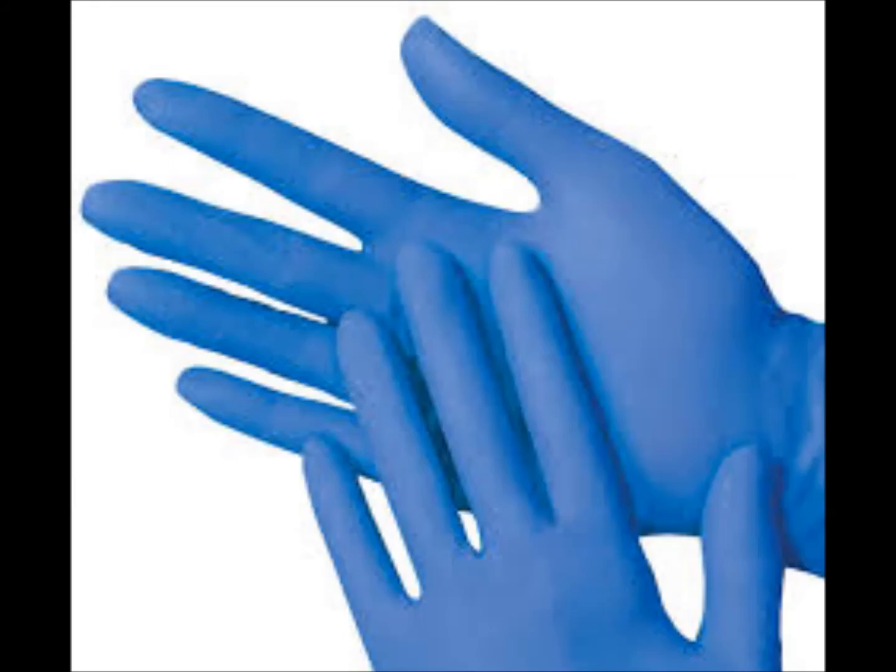Now that we have covered why a patient undergoes a tracheotomy procedure, as well as a review of the trach tubes, we will now review what to keep in the patient's room when caring for these patients. First and most important is gloves. Always remember to wash your hands before doing any type of trachea care. Tracheal suctioning is considered a sterile procedure, while tracheal care is a clean procedure. Suction kits as well as the tracheal cleaning kits come with sterile gloves.